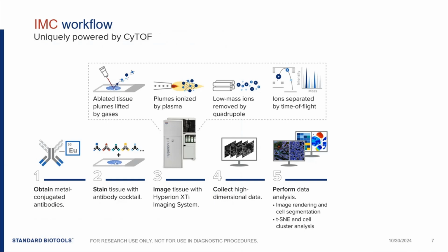Secondly, if you are familiar with fluorescence spectra, you'll know that excitation and emission spectra are very wide and broad, and they do have significant overlap with multiple other fluorophores. But with IMC, imaging mass cytometry, the detection of metal isotopes using time-of-flight mass spec results in very discrete signal signatures, giving you the confidence that the signal you detect is uniquely associated with an individual target in your panel.